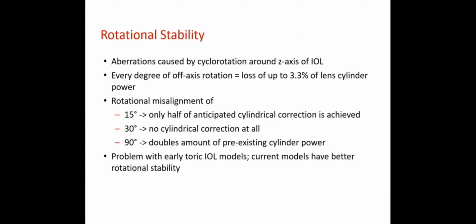Yinghui is asking, if the doctor uses IOL Master, would you use K values or TK values for IOL calculation? There is a modified formula. Whatever formulas we were using in the past, like Barrett or SRK/T, when they are using the TK values, there is a modified TK formula.